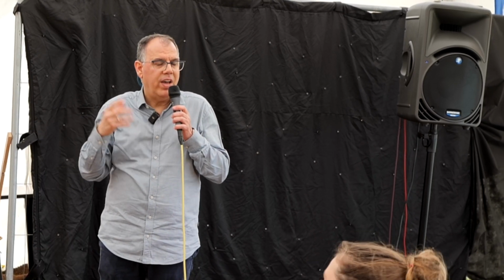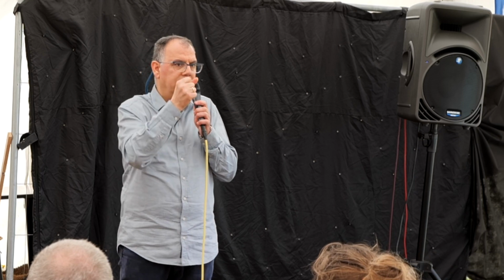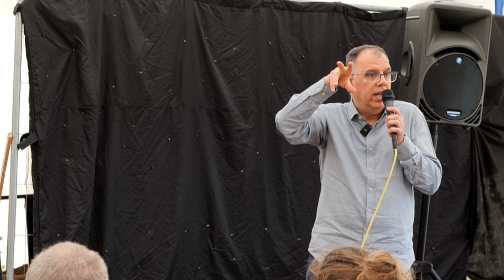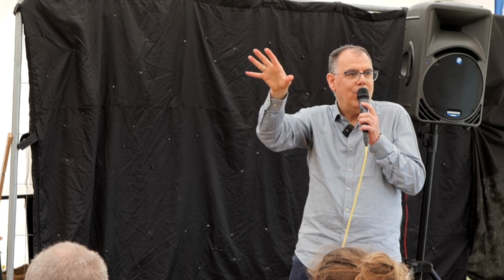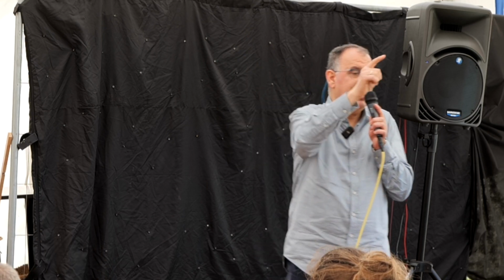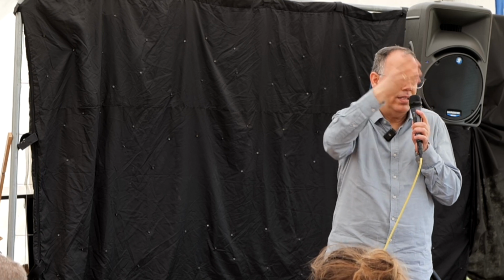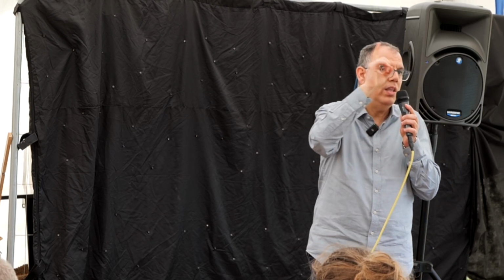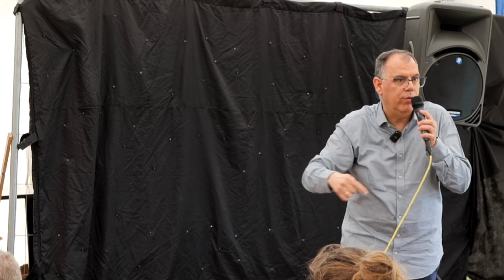One of my cases, I showed the young boy, we have had, and not only this guy, we have had the periodontium, I mean the ligaments around the tooth, come back after the laser application. So after killing the bacteria and stimulating the tissue regeneration, many stem cells turned into surrounding tissue cells, healthy cells, with the laser application. That one, as I said in my presentation, you cannot achieve any other way. Only the laser could really regenerate all types of tissue around the tooth.